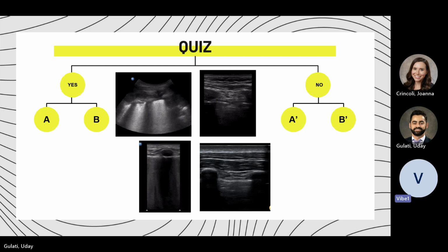Yeah, just to go over real quick, so when you are not seeing lung sliding or you're concerned for it, you put it on M mode. The findings on M mode would be the same as if there was a pneumothorax, correct? But you're looking at the fact that there's a lung pulse when you're on a real-time ultrasound.